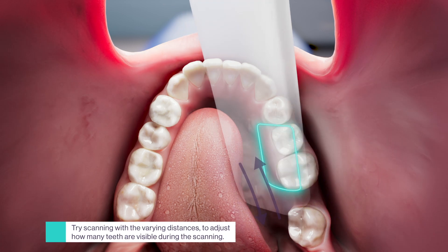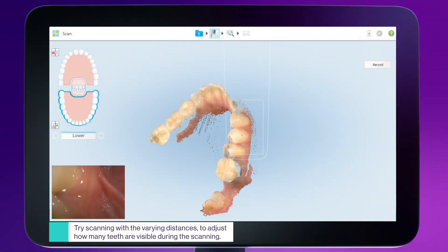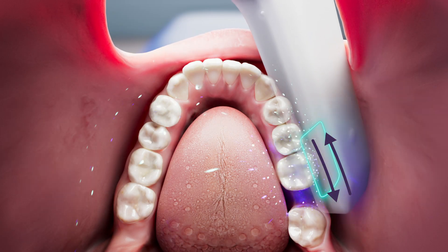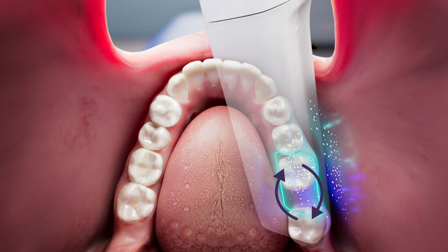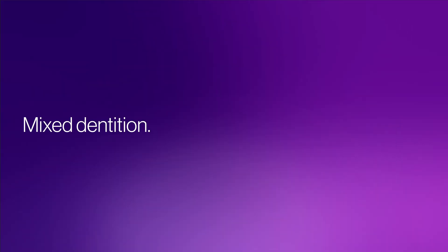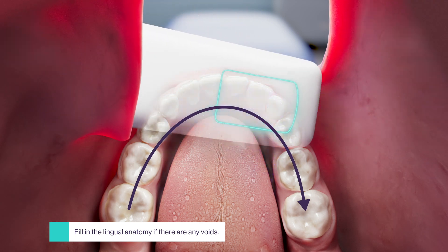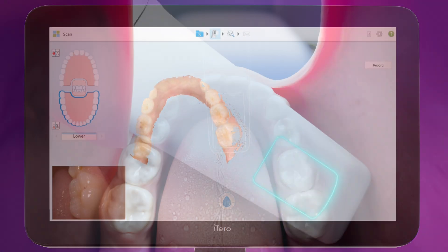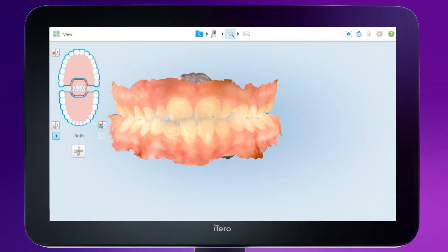To ensure the capture of the interproximal surfaces, while scanning from the buccal and lingual directions, tilt the wand at an angle to the interproximal surfaces and scan in a brushing motion. In some cases, you can also use the rocking motion to capture more anatomy. Leverage the large field of view to scan children and small mouths. While hovering over the occlusal surface, simultaneously capture the buccal and lingual anatomy by bringing the wand to the opposite side of the arch, then retract the cheek with your fingers to fill the missing buccal anatomy.